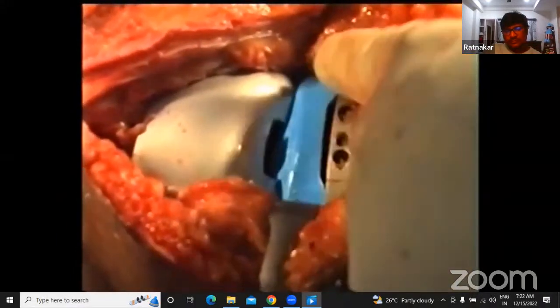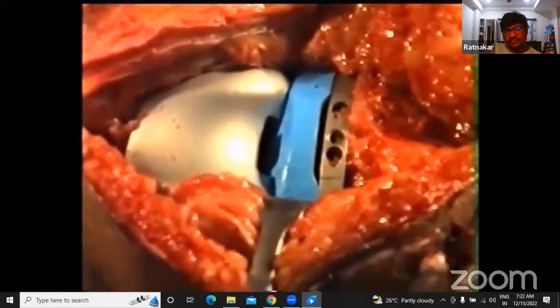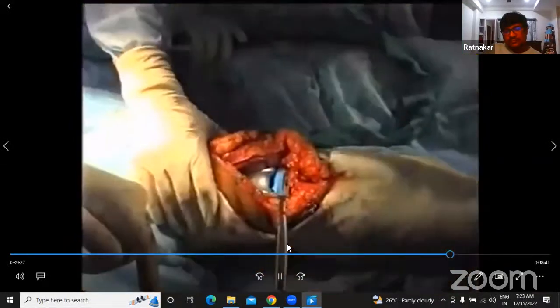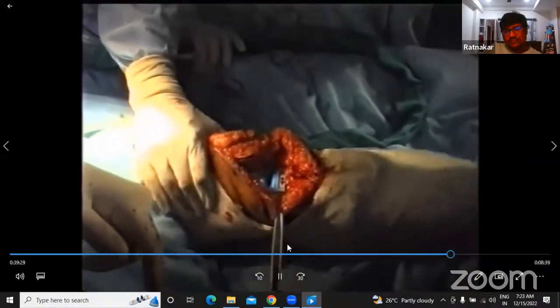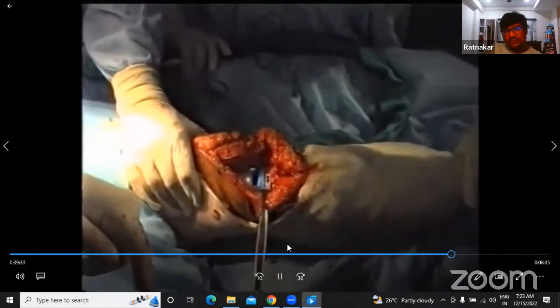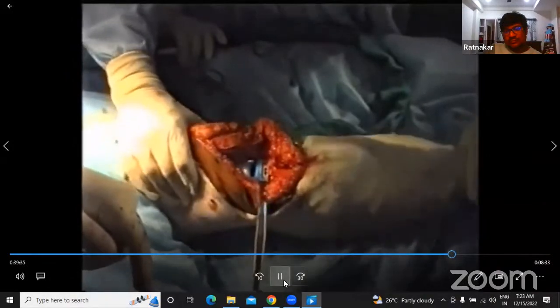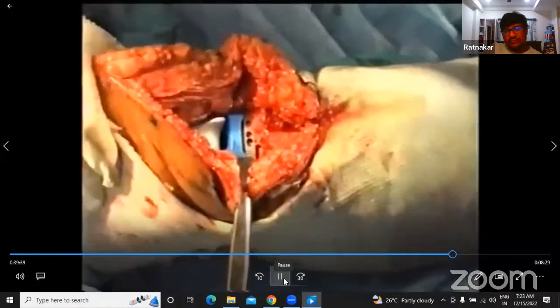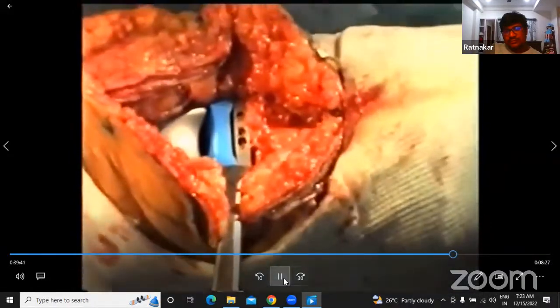And this cut is perpendicular to the vertical axis, right? And now I'm doing the rock. Now in extension, I'm doing the rocking there. It looks rock solid. At the most, there can be 2 degrees of movement there, but it looks solid. Stable. It's quite stable there. Okay, that is criteria one. When I flex the knee.